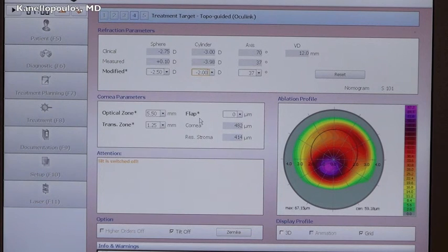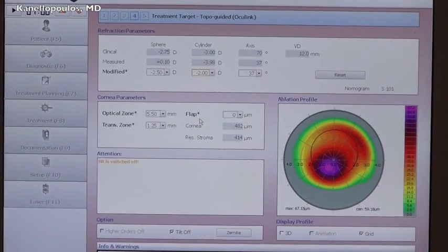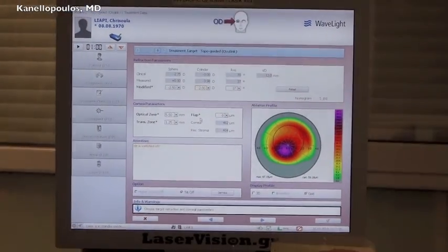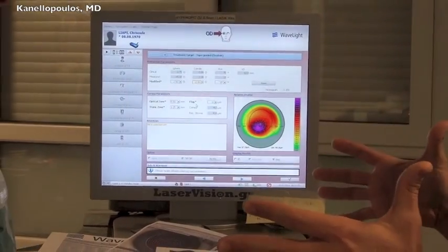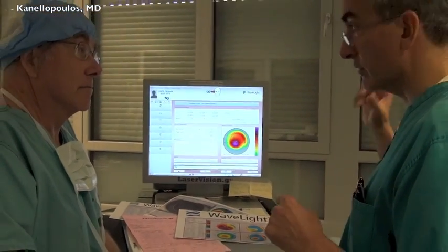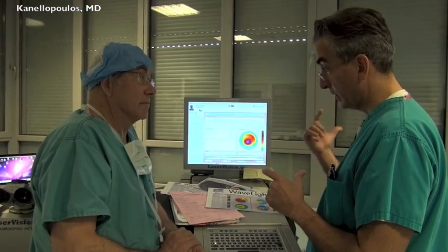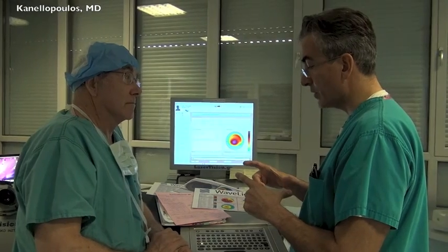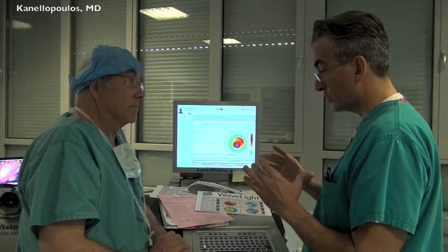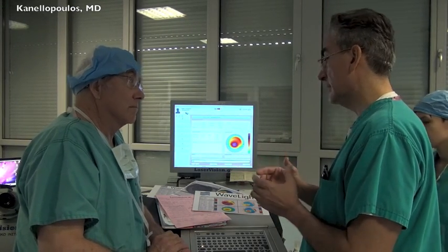Not only that, this laser has a disadvantage, which for these cases, in my opinion, is an advantage. Within its PTK protocol, it uses the same firing algorithm as plain myopia, so it puts more shots in the periphery. So at the PTK, while we treat this patient, down around 50% through the treatment, PTK will be 6.5 millimeters in diameter, we'll see the epithelium starting to blacken in the periphery, which means we're at Bowman's membrane. 50% through the PTK.